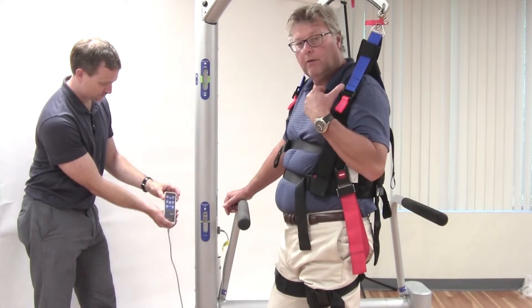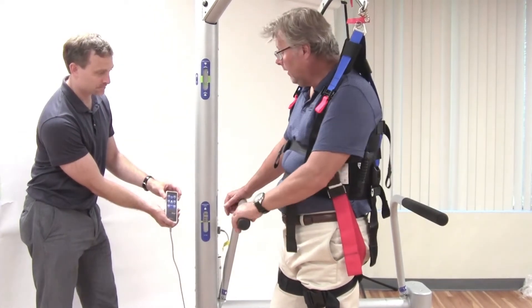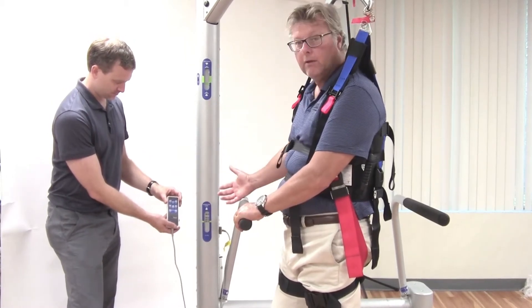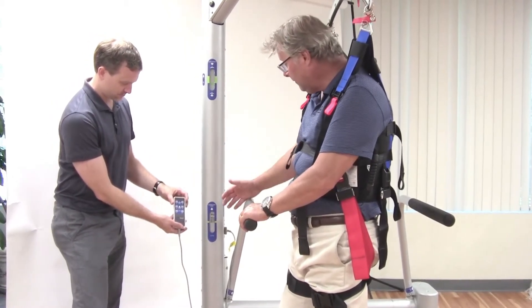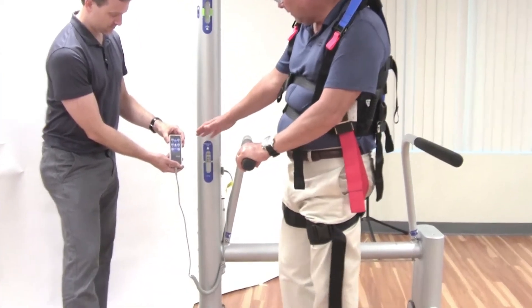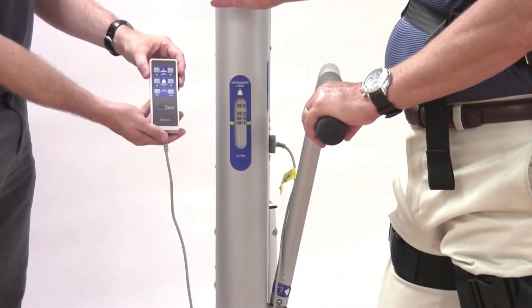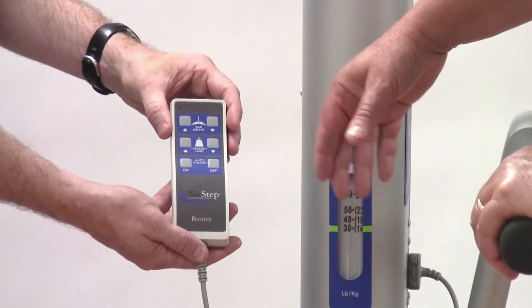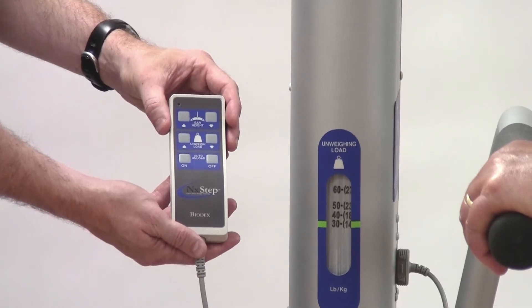Once the patient is in the harness, the clinician can go about setting up the unweighing load and adjusting the bar height. The hand pendant makes it very simple. There are a series of six buttons which are basically up and down or on and off. The top button is for bar height, which will move this bar up and down.